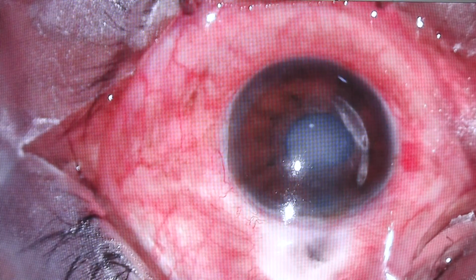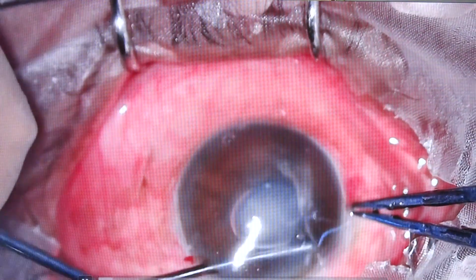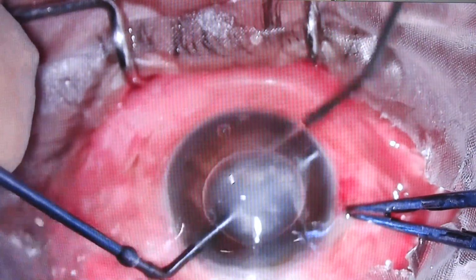Another case, this is a one-eyed case, post-traumatic, previously recorded 0.9 CDR. There was a bleb leak, and for that I put a large size BCL first, but on follow-up there still was a leak. So then here I planned to form the AC and do a graft. So amniotic membrane can be used to repair blebs. Due to long-standing flat AC, a lot of anterior synechiae had formed.